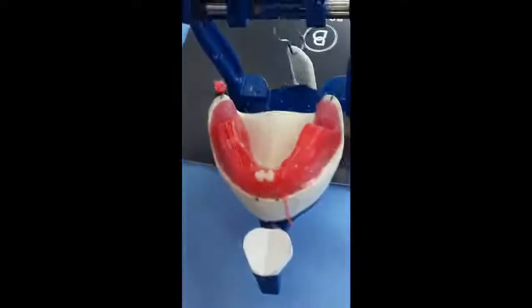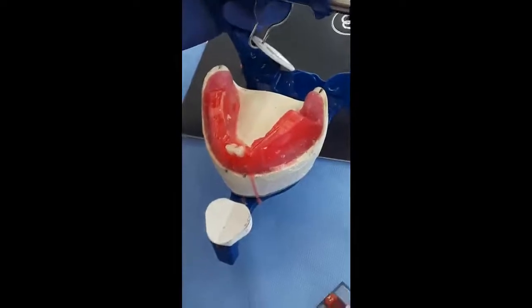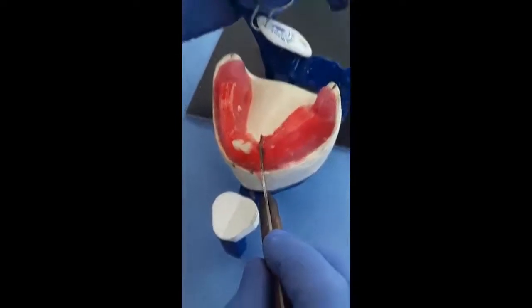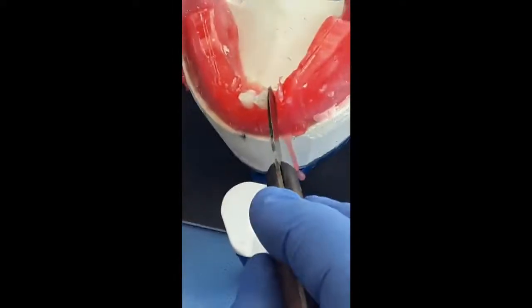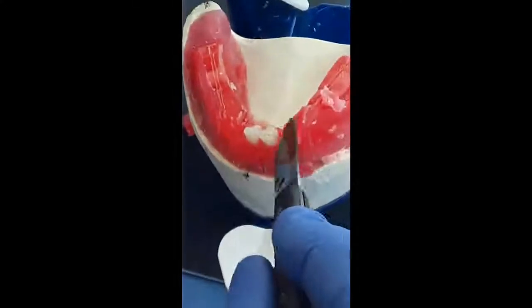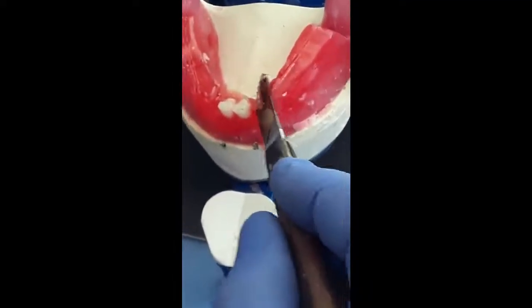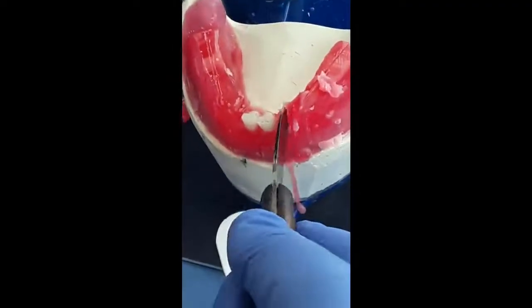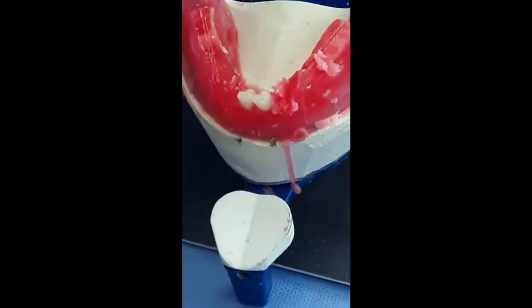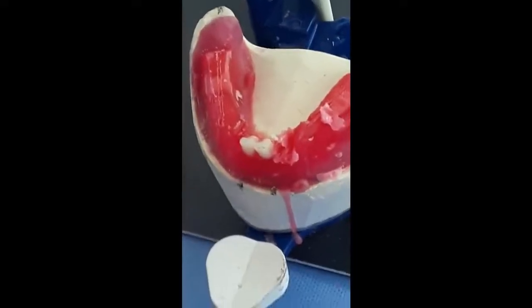Now we proceed to the setting of the lateral incisors. We cut a piece of wax and melt the wax inside, and we continue the curvature of the arch.